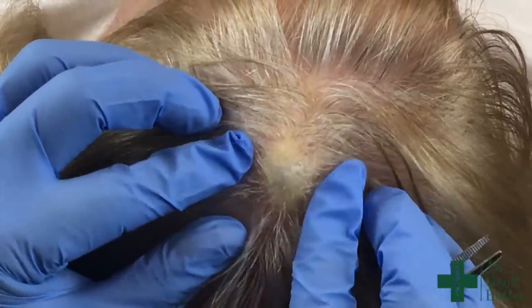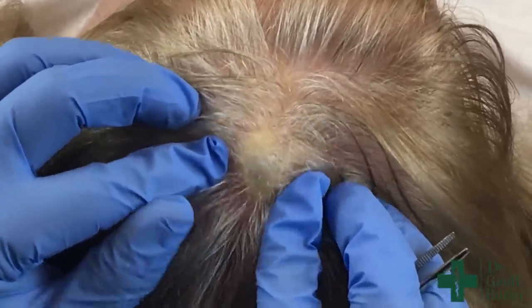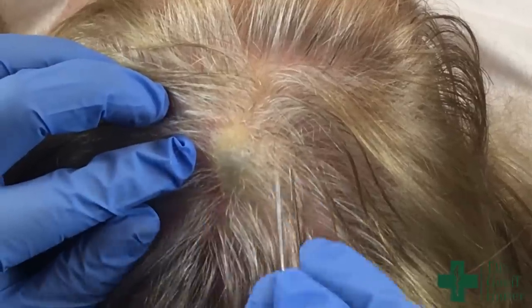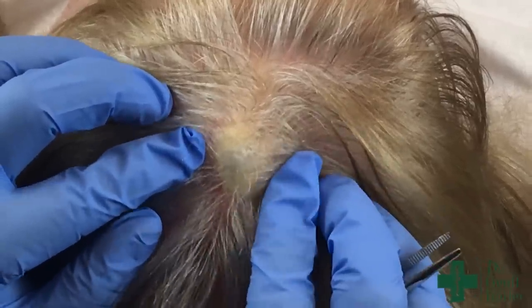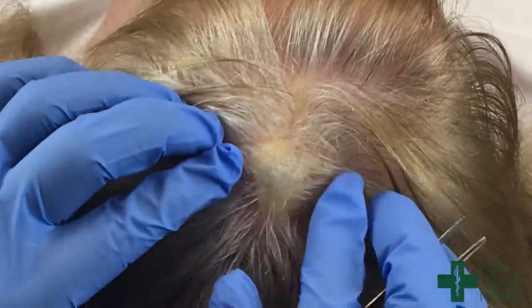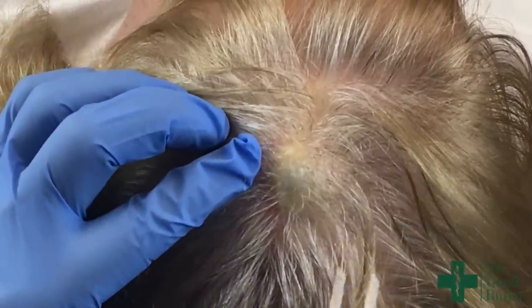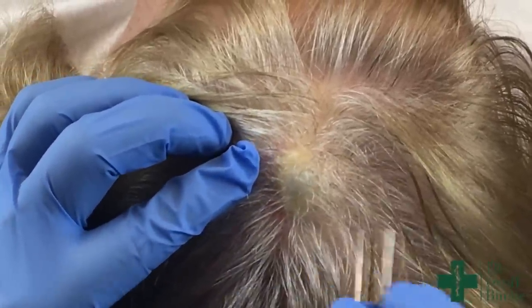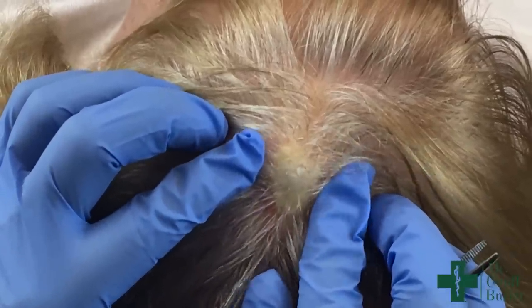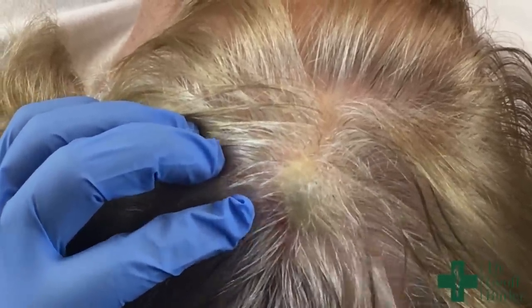Matthew's the resident who's helping us. So Matthew, do you remember what kind of cyst this is? Pilar cyst? Yes, so this is a pilar cyst. These used to be called sebaceous cysts, which has been a misnomer. If you see them on open tissue, they're usually epidermoid cysts because they're derived from epidermal tissue. Pilar cysts are derived from the base of the hair follicle, which is called the pilar cell, and this is why they're called pilar cysts.